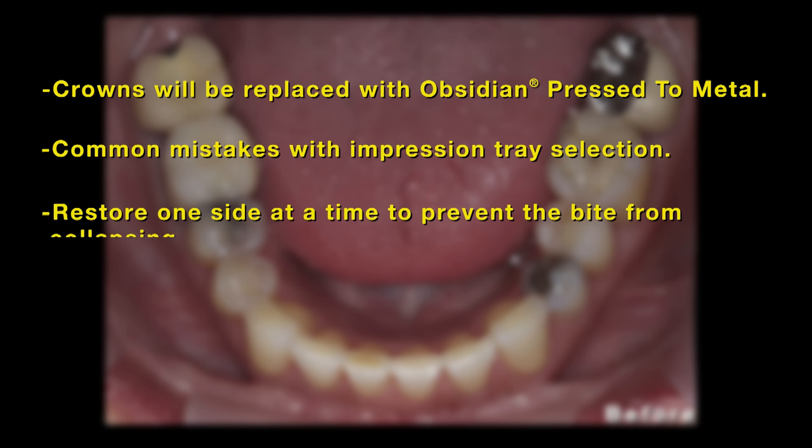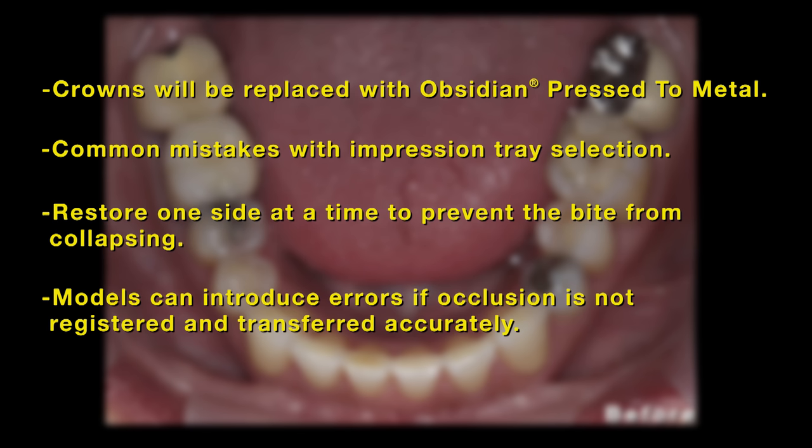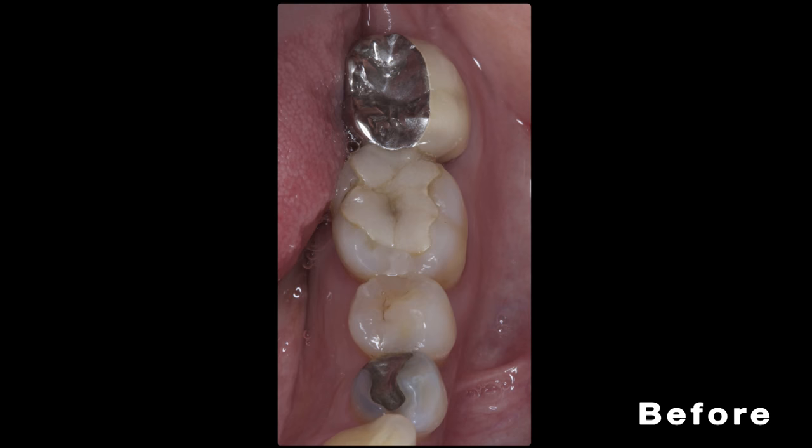For this case, I preferred to restore one side at a time, so the occlusal contacts on the teeth on the contralateral side will remain unaltered and prevent the bite from collapsing. The articulated models can introduce errors if occlusion is not registered and transferred accurately, or if impression tray selection or bite registration is wrong. So I started with the lower left side first. We can see the first molar had a lingual crack and there was recurring decay under the large composite filling. On the second molar, we can see a PFM with metal on the lingual and on the entire occlusal surface.